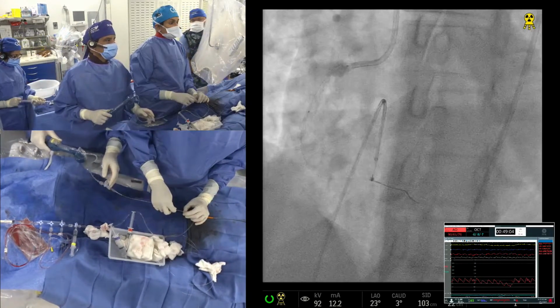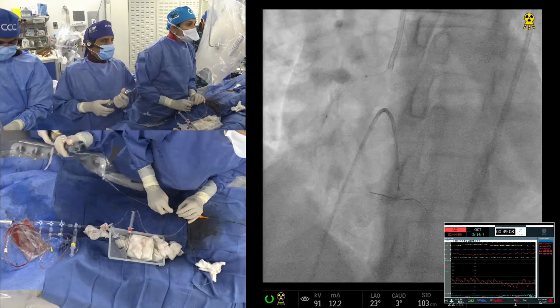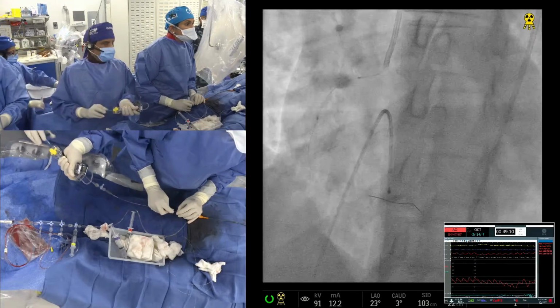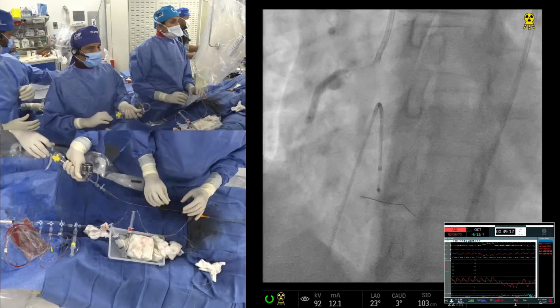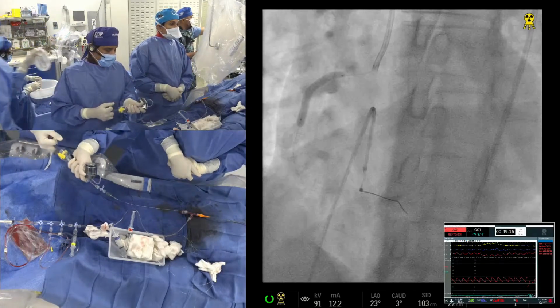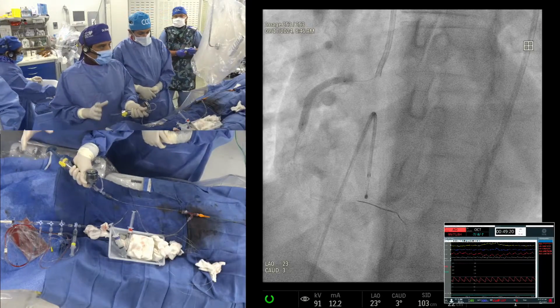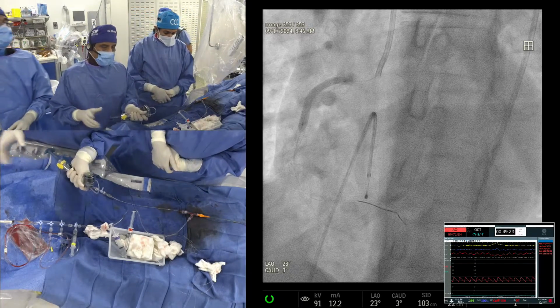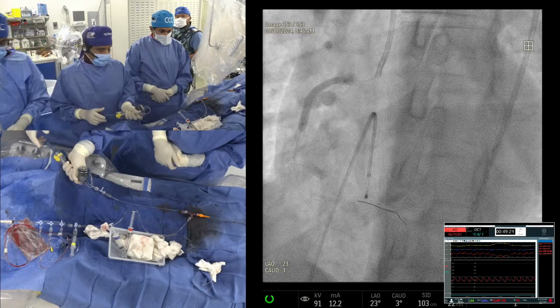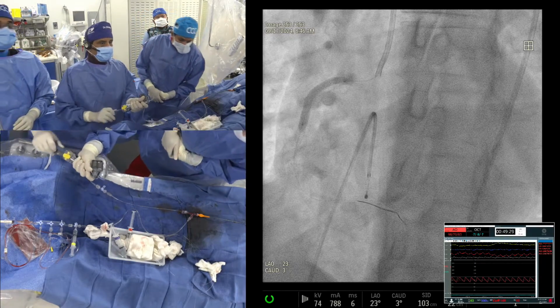Yeah. And this is the case which we said, if possible, you need a pacemaker. Now, we didn't need a pacemaker here, but we wanted to do more vasodilatation. This is the case who can develop AV dissociation and so. So this is the type of case where I will try, not relying only on atropine and aminophylline, that we go with the pacemaker.